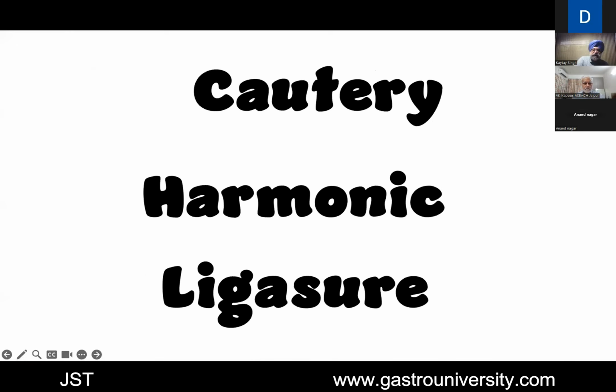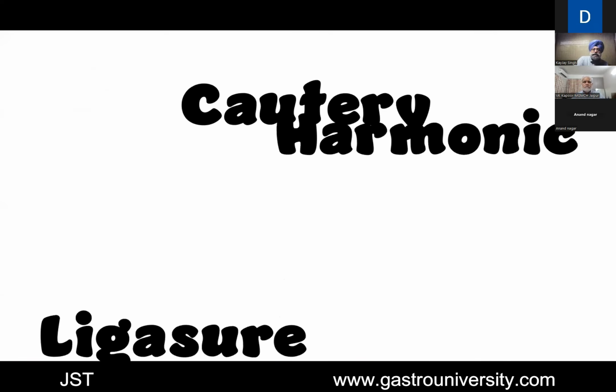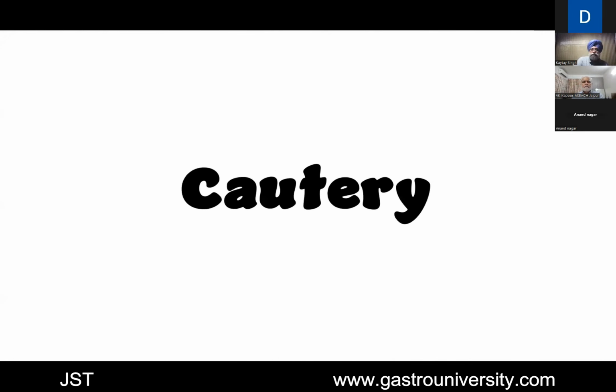Energy devices are of three kinds which we use in laparoscopic surgery: cautery, harmonic, and LigaSure. I will be limiting myself more to cautery because today's session is primarily on laparoscopic cholecystectomy, and we use this aspect more. In very specific cases, we use advanced energy devices.